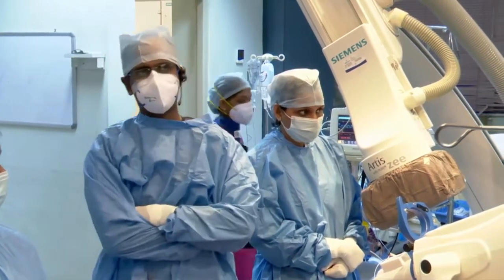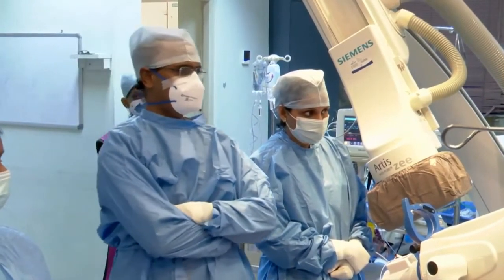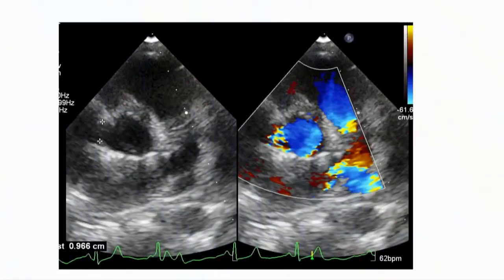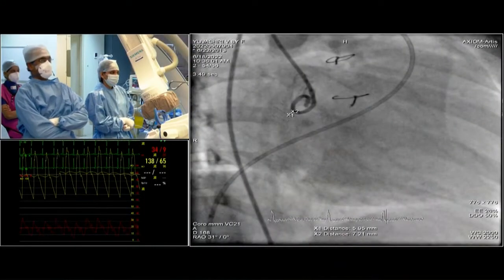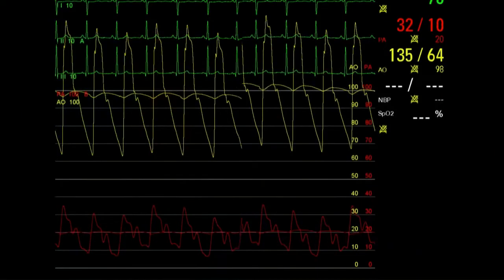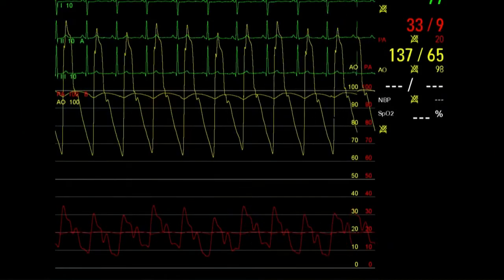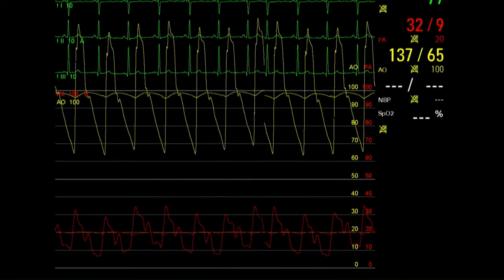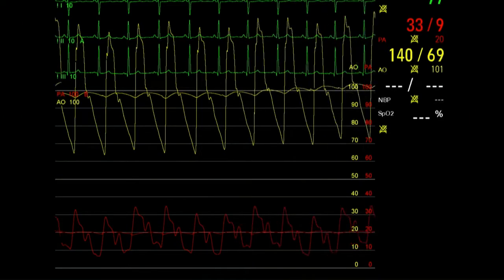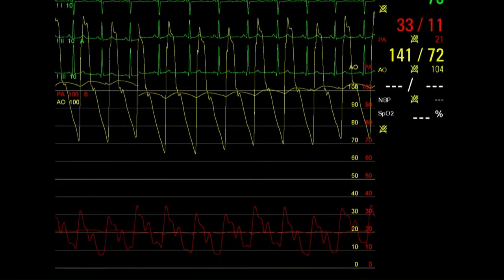It is classically coming from the non-coronary cusp. Additional views have not been loaded in the PowerPoint, but we can proceed. Now I would like to show the hemodynamics: you can appreciate the wide pulse pressure. Pulmonary artery pressures are not very high — around 33 by 10 with a mean of 20. We did not calculate Qp:Qs due to time constraints.